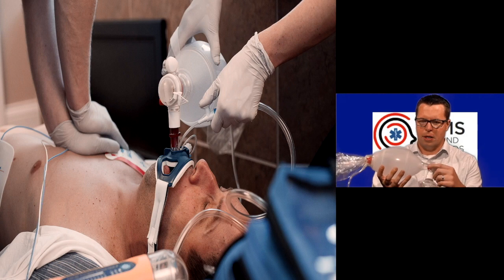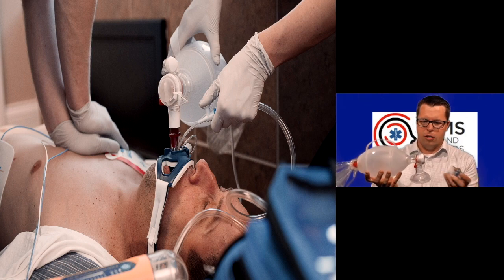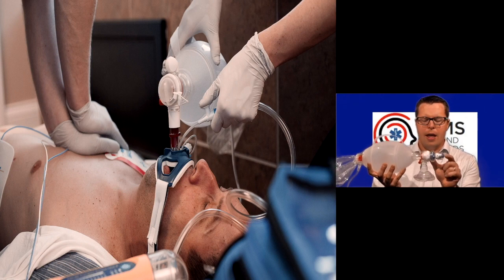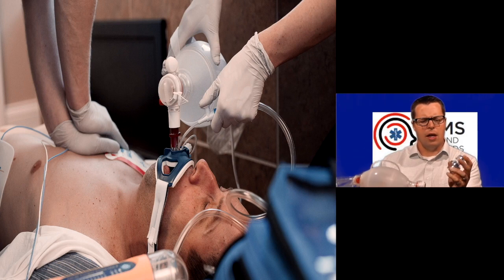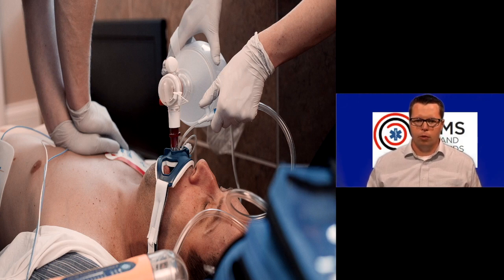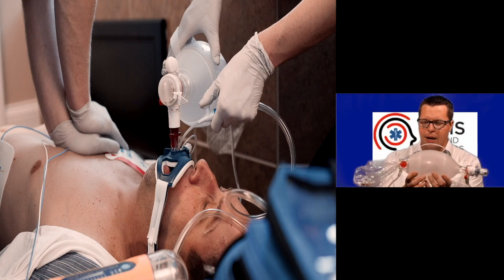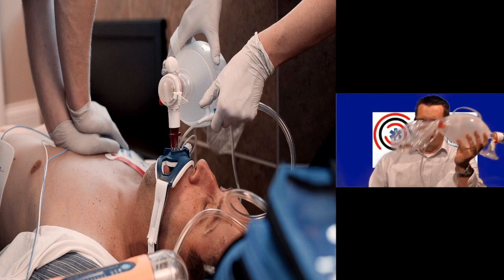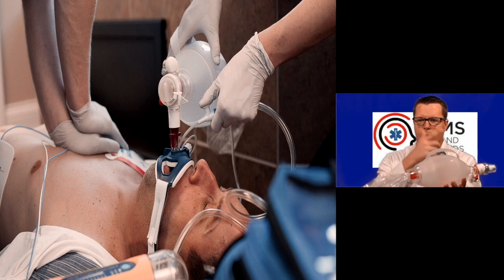Somewhere along the way there's probably a pressure valve or something you can attach to it, a little manometer, something like that. If you have a PEEP valve attached, it goes right on the end of that exhalation port, and the PEEP valve on these things is a spring-loaded valve. It's just a little spring in there with a piece of rubber that, when pressure exceeds about 10 centimeters of water, opens and lets air flow through. It keeps it in there theoretically up to about 10 centimeters of water, or whatever you have the PEEP valve set at. That's the basic anatomy of the bag and how it works. So if you were to do this right now, not hooked up to oxygen, squeeze it, it's going to draw in air from the back and deliver 21% O2.